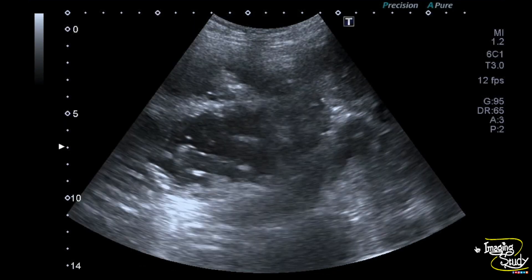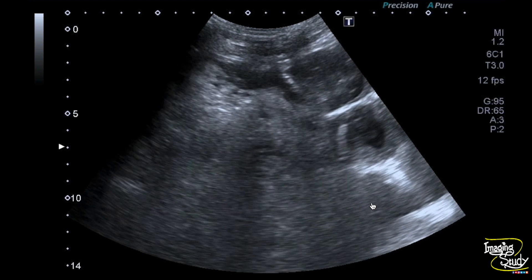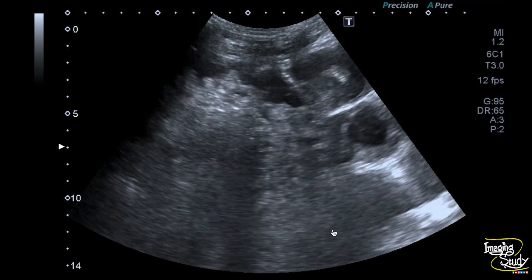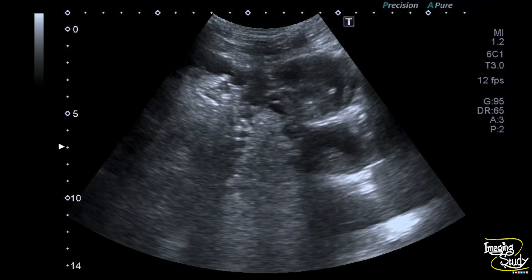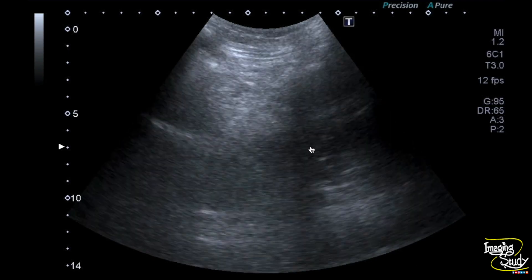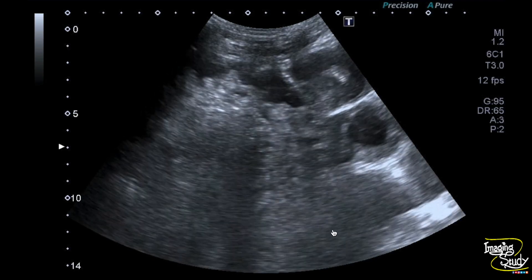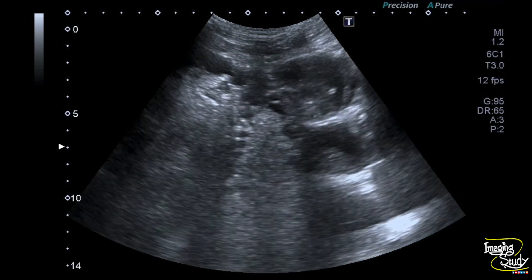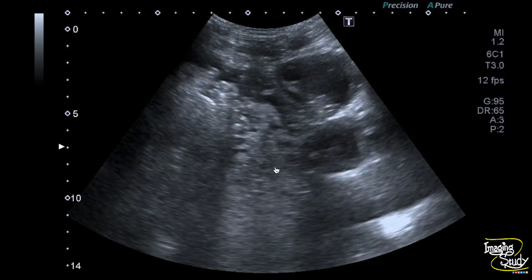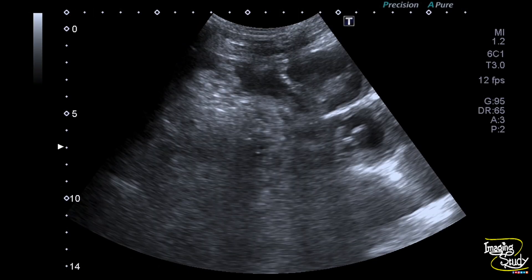Here is the curvilinear transducer view and you can see these distended bowel loops are having to-and-fro flow within. You can also see some echogenic mural content, and you can see that in the patient there are multiple air-fluid levels. Here's the picture of this fluid-filled distended bowel loop with intraluminal contents and echogenic air.